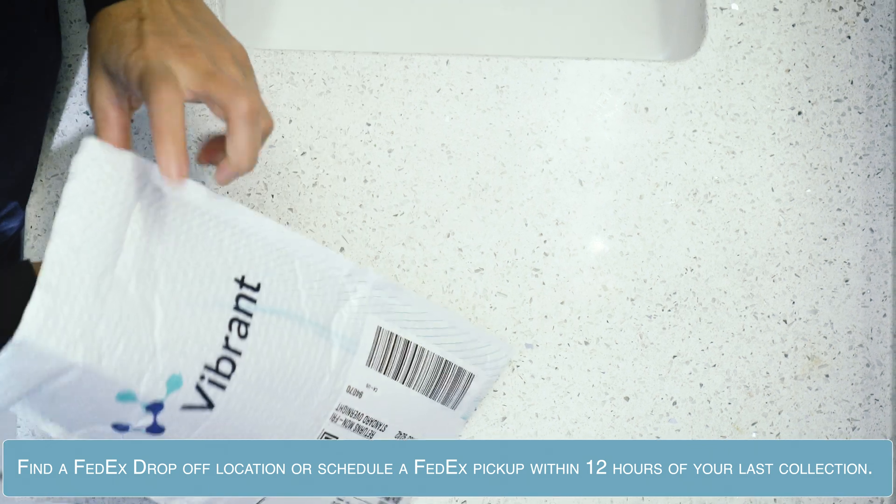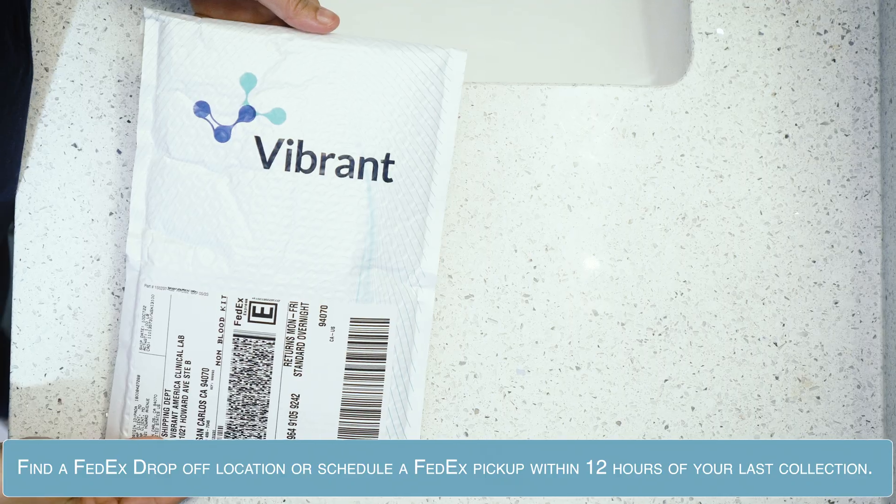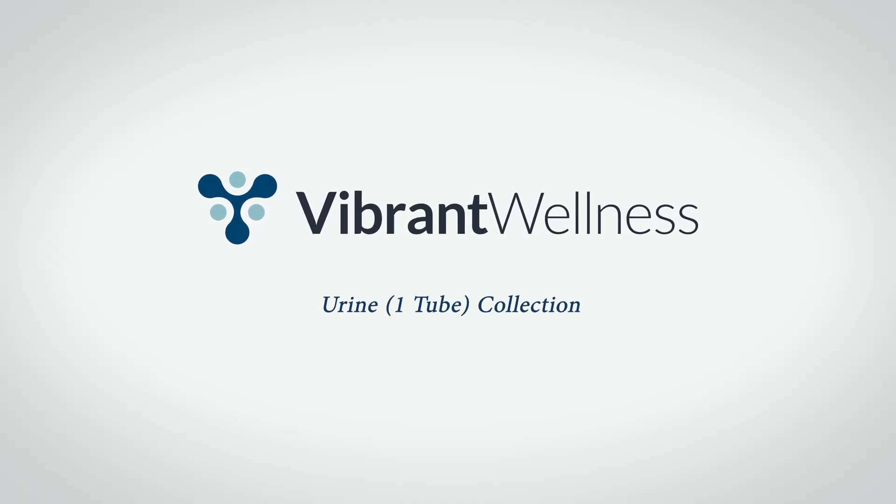Place the biohazard bag in the FedEx return label. Find a FedEx drop-off location or schedule a FedEx pickup within 12 hours of your last collection. Thank you for letting Vibrant Labs be part of your wellness journey.